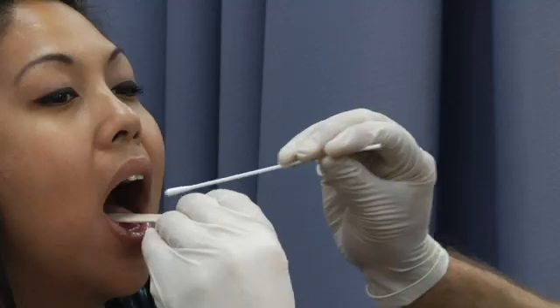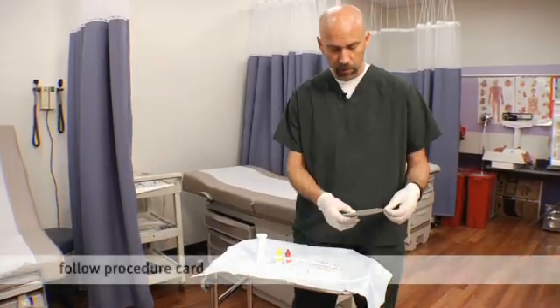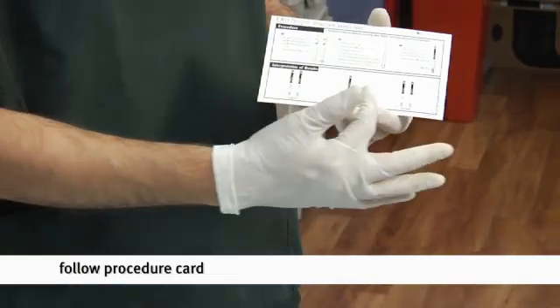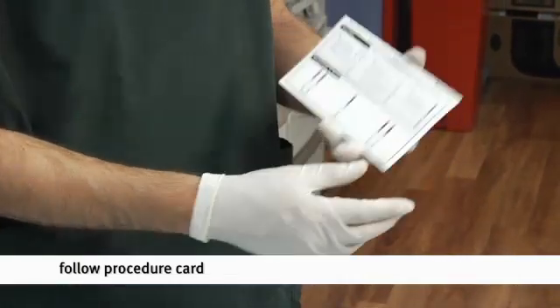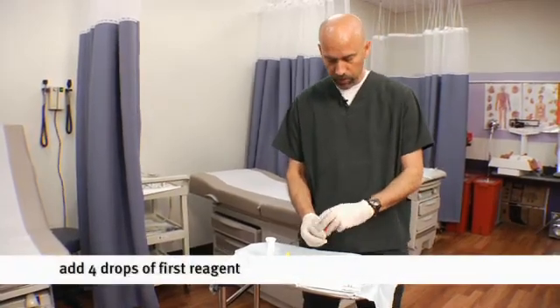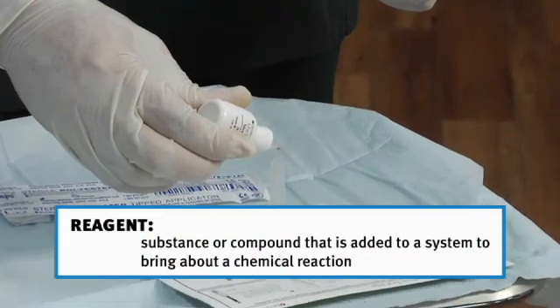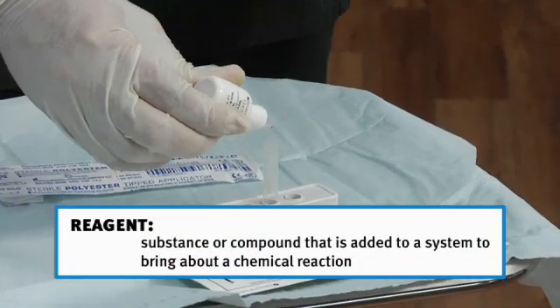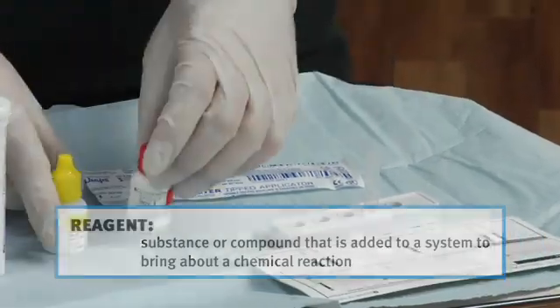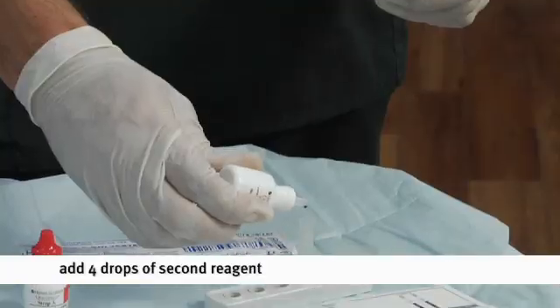Okay, we're ready to test the sample that we got from our patient. The first thing we're going to do is follow along with the procedure card that comes with every test kit, and it's going to tell us in step-by-step instructions how to complete the test. First thing we're going to do is add 4 drops of our first reagent. All right, our second step is we're going to add 4 drops of our second reagent.